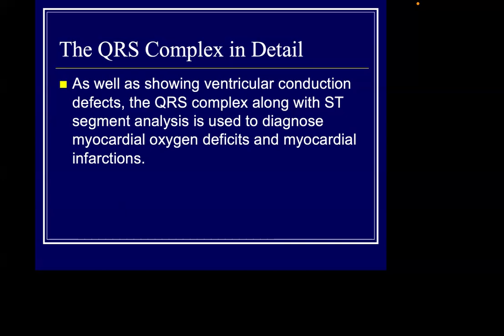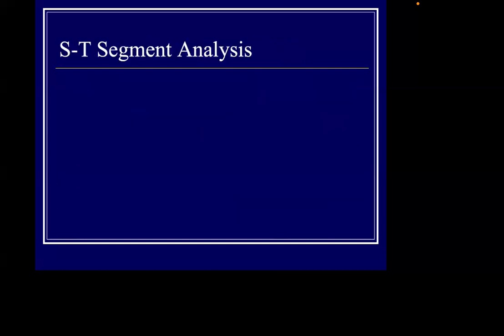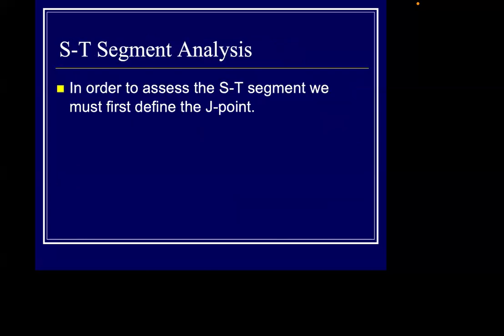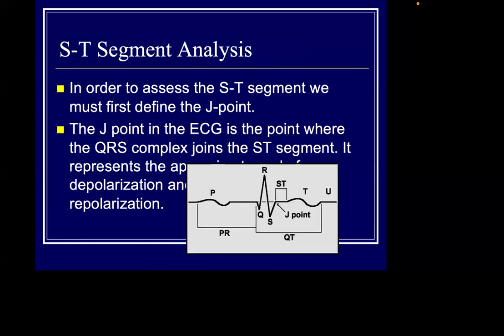This will aid in the rapid diagnosis of these serious conditions so that treatment can be obtained early. So the QRS complex and the ST segment should be assessed very accurately to assess the abnormality.